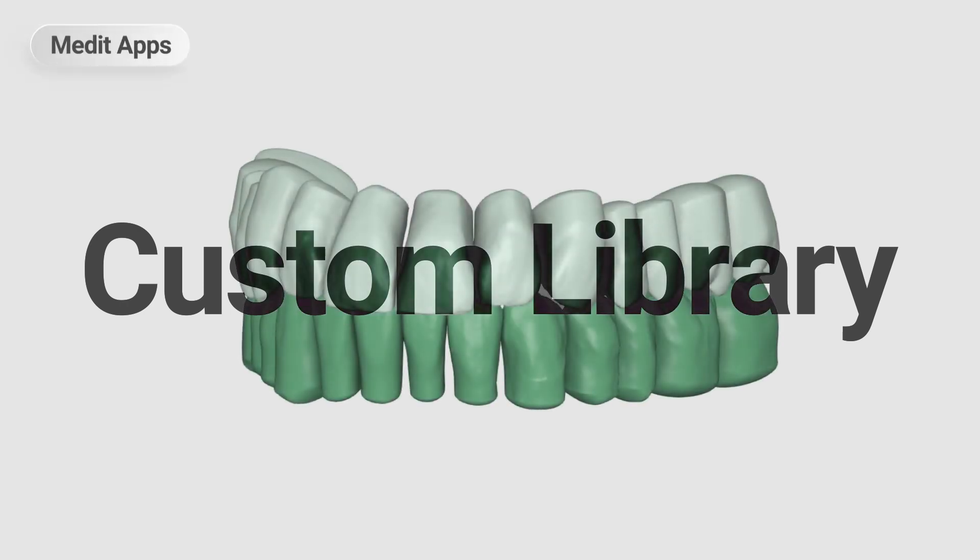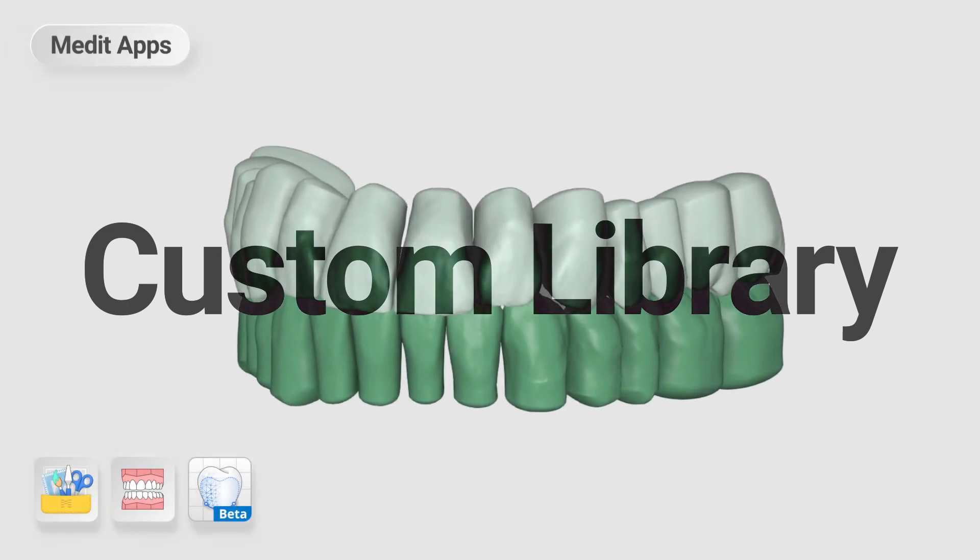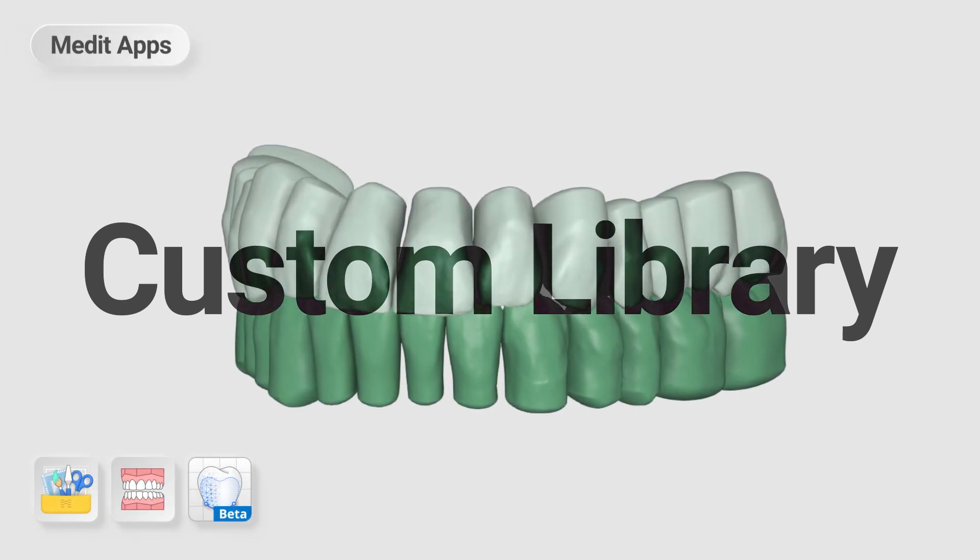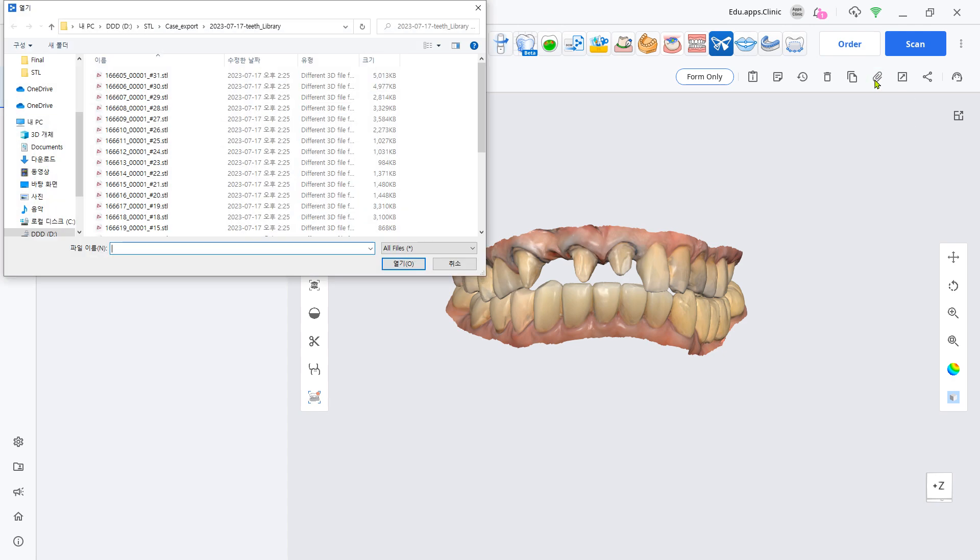This is a guide on how to import and use the third party's teeth library with the Clinikad app. In the scanned case, attach the teeth library STL you want to import.